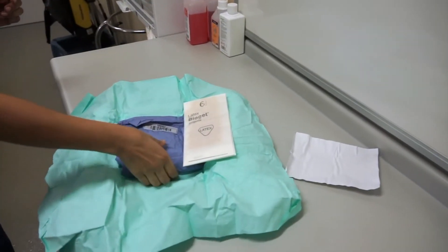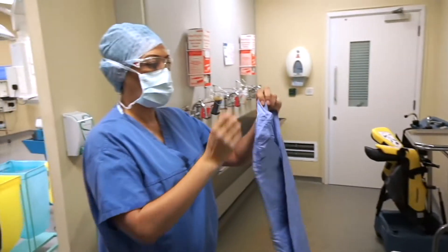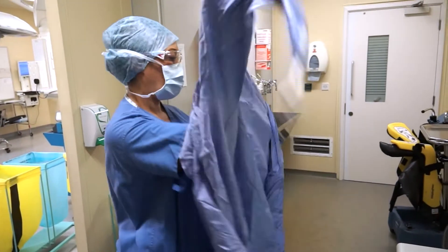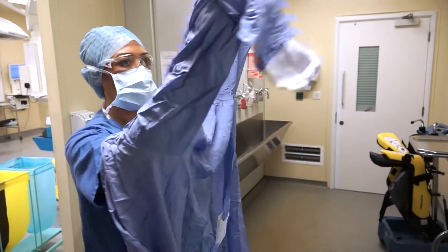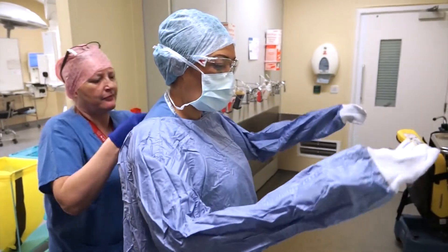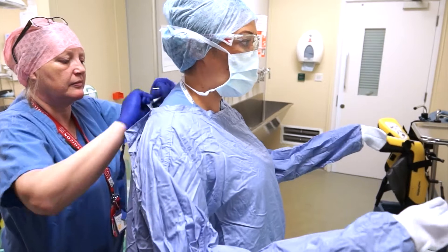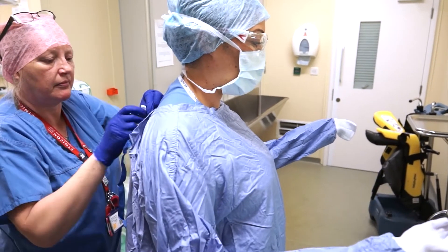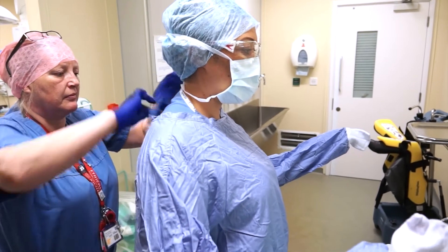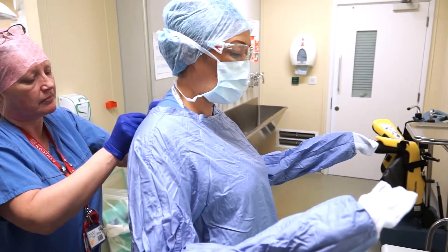Now I will lift the gown, support it — hold the neck of the gown there and just let it give a little shake, and it all falls out. You don't unfold it, you just let it naturally unravel. Arms up and then get assistance to tie you up at the back. I'm keeping my hands below the level of the cuff just to make sure that my fingers don't pop out — so nothing's showing. Really important not to scratch your nose at this point — don't scratch your nose.